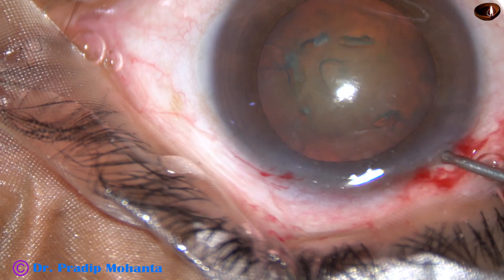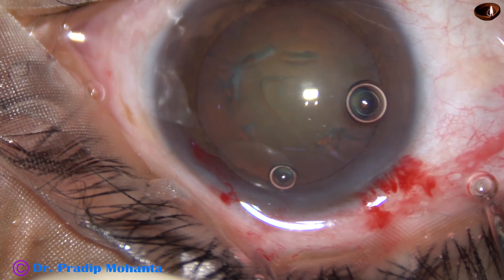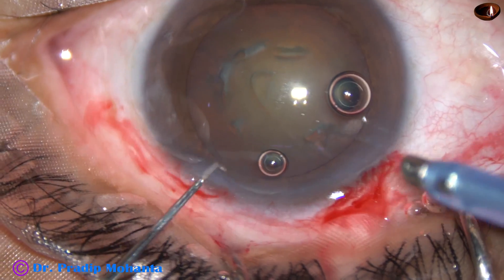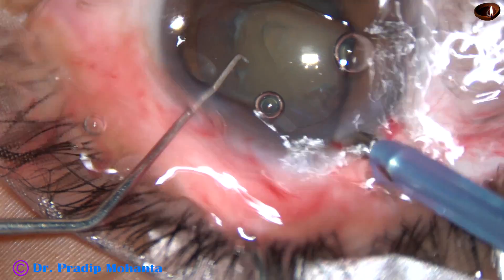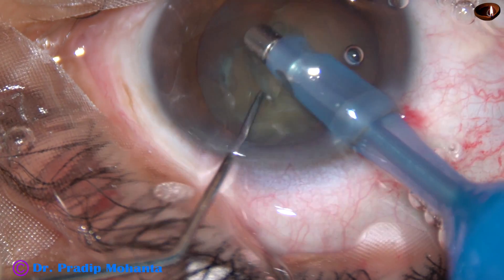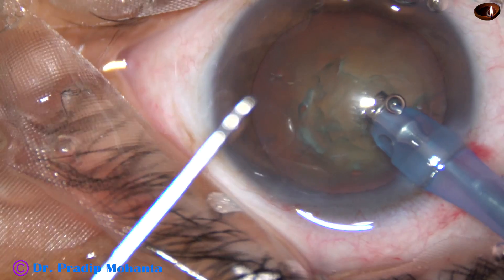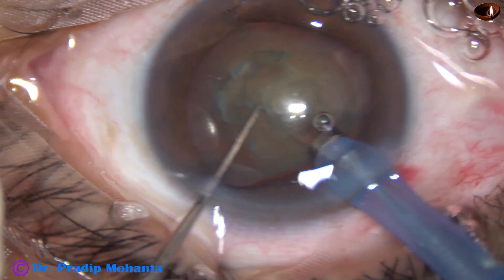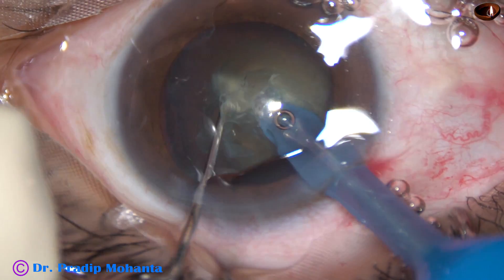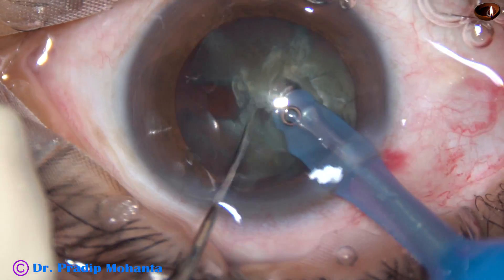Some more visco is injected into the anterior chamber. We can see that the nuclear sclerosis of this cataract is grade 3 or grade 3+. The machine being used is Oertly Cataracts 3. Here goes the phaco tip inside the eye. The air bubble is removed and some superficial cortical lens matter is removed. Now, this is direct chop. The tip is buried into the substance of the nucleus, and as it crosses the central part, the nucleus is chopped. The nucleus is then rotated and chopped at another place.